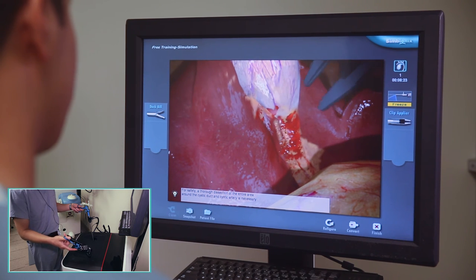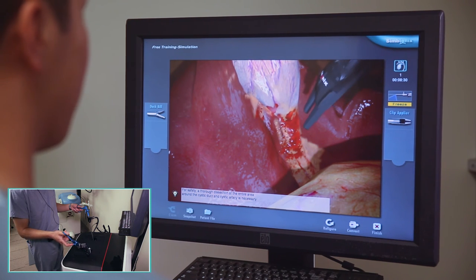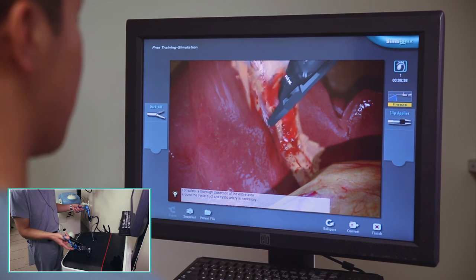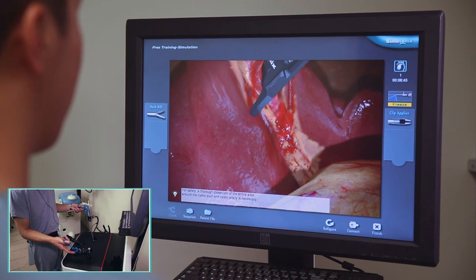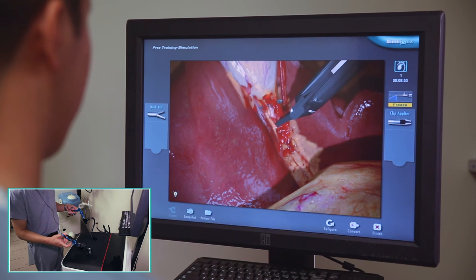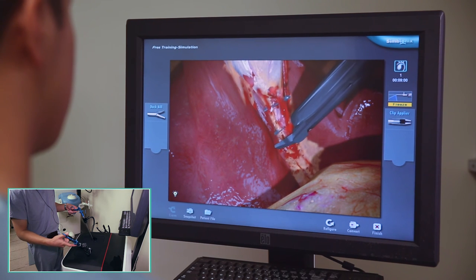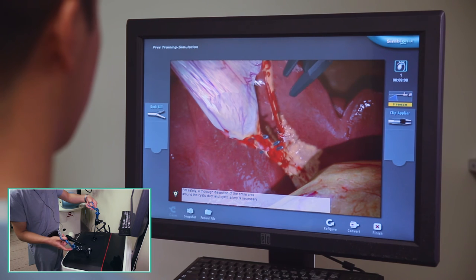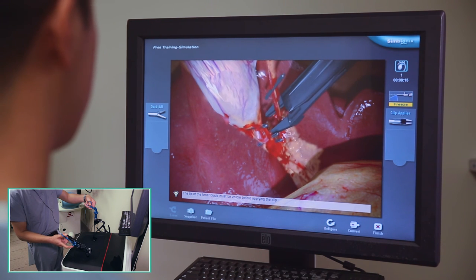I have my clip applier angled so that I can see the posterior tip — the one further away from me. I'm going to get this here, pull it towards myself, and I can see both tips of my clip applier, which means I know exactly what is between the jaws, and I'm safe to apply my clip now. I'm going to push up towards the gallbladder and then squeeze nice and hard. I'm going to flip my clip applier around — clipping once on the specimen side and twice on the patient side. Same thing: clip once on the specimen side for the cystic artery, flip it over, and clip twice on the patient side.